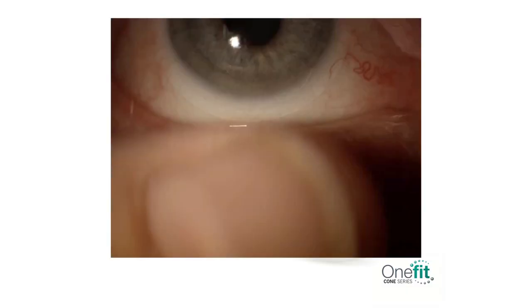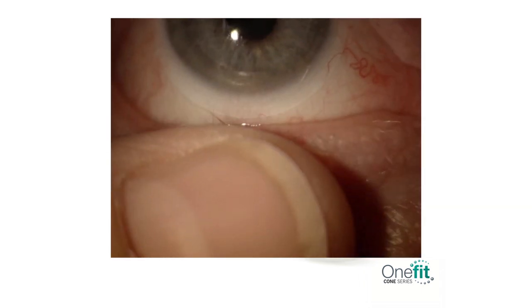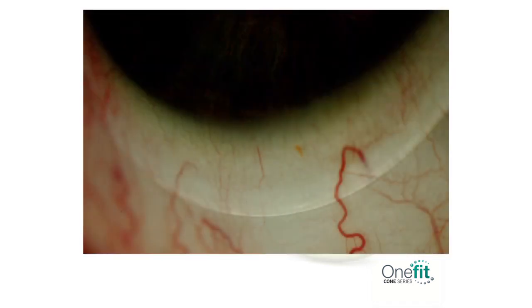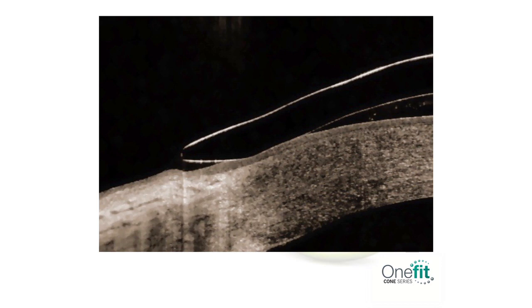After selecting the base curve that provides optimal clearance between 150 and 175 microns, evaluate the edge lift. Look for conjunctival alignment to ensure there is no edge standoff or peripheral seal-off. This image represents an optimal conjunctival alignment with no edge standoff or peripheral sealing or blanching. Here we see an OCT view of optimal edge landing on the conjunctiva. This is another OCT view of excessive edge standoff causing discomfort. And again, through the OCT, we see an edge that is too steep, causing conjunctival compression with the potential for peripheral seal-off and blanching.